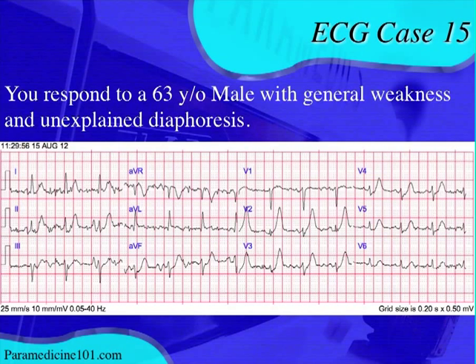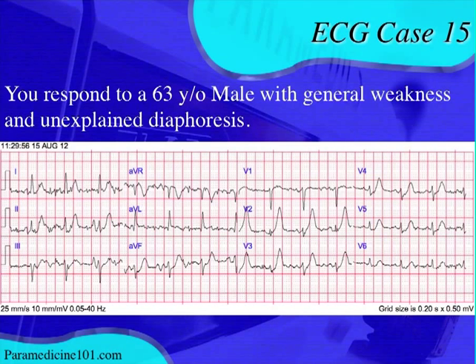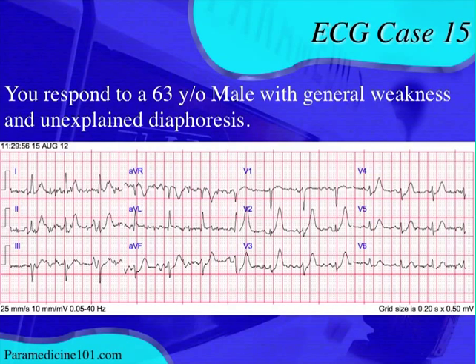First, we want to identify the rhythm. The best place to do that on this tracing is the precordial leads. Looking there, we can see P waves — right there, right there, right there — no extra P waves, and the PR interval looks pretty constant. It looks like we have a sinus rhythm: regularly regular, rate's not too bad, narrow complex for the most part.